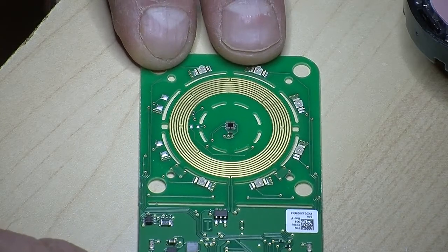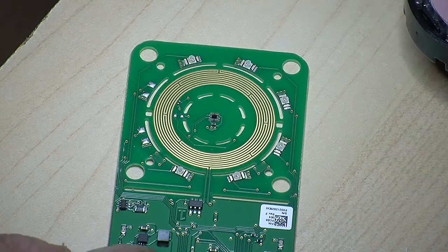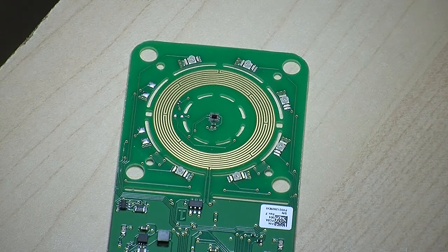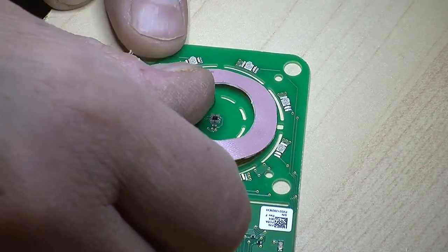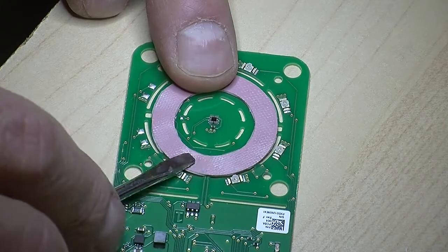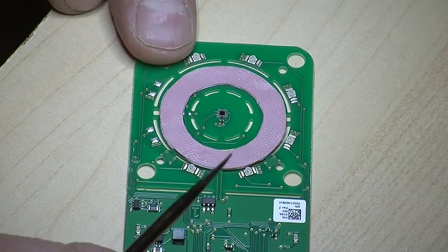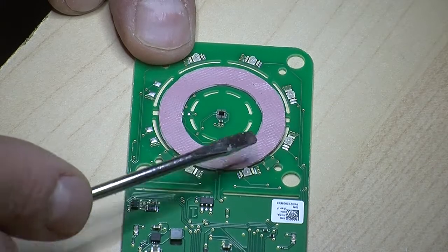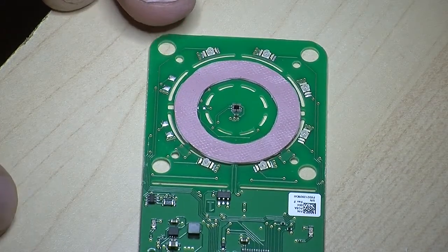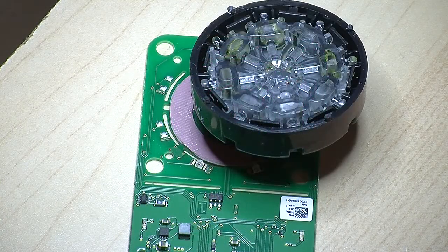Most likely what happens is it is a very narrow trace and enough current is passed through it so it gets nice and hot, and then the pink donut that was on the plastic thing sits on top of it, and what that probably is in fact a thermal pad, just like you often get on computer processors, between the processor and the heatsink. So this pad here serves as a way to conduct the heat to the plastic module in which all the chemistry takes place.